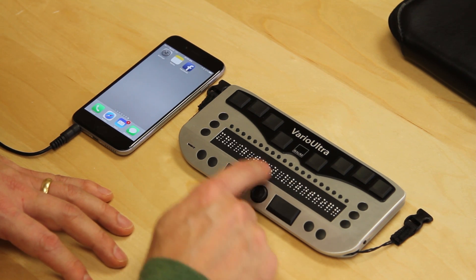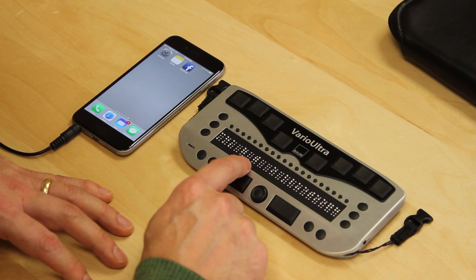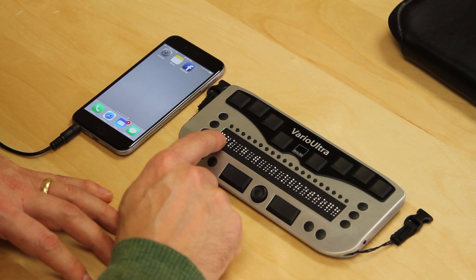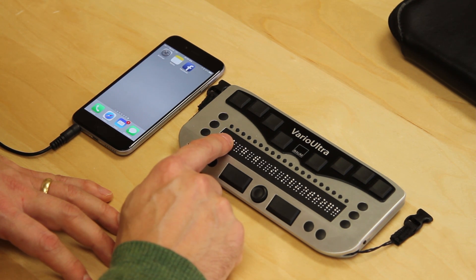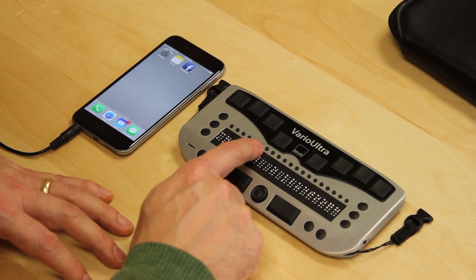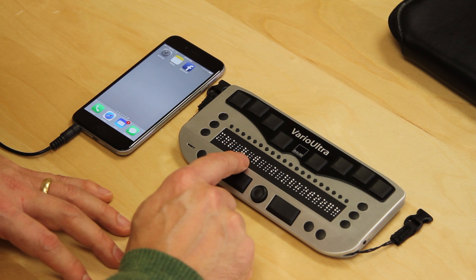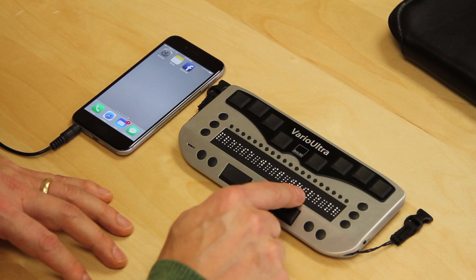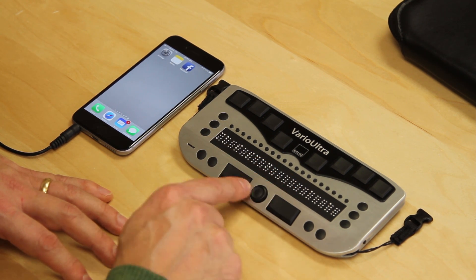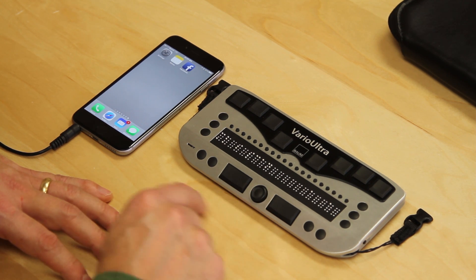I go into the Bluetooth submenu and what I see here is a check box — the letters CHK at the very beginning indicate this is a check box. The check box is empty; I just see two brackets. To turn on Bluetooth, I can either press the cursor routing button above the empty check box, which will cause Bluetooth to be switched on, and the Braille display gives me a message confirming that. The other option is to press the NaviStick button and go to the right.